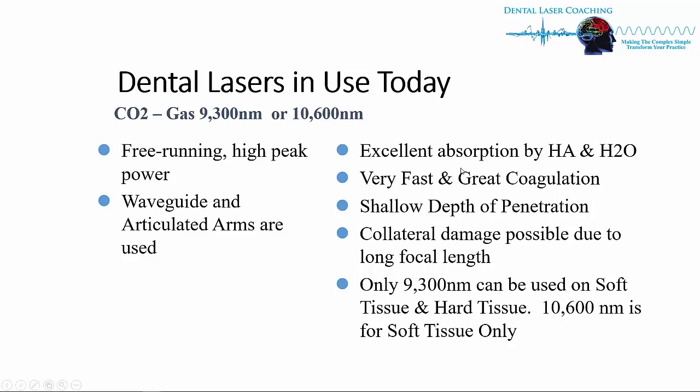Though they're thermal, they only interact on the surface when used properly. And I say that with caution because you can have collateral damage. For those of you that are used to using a diode or an erbium, you know that you have to be 0.5 millimeter to 1 millimeter off the target tissue. With these lasers, you can be inches off the target tissue, so the possibility for inadvertent collateral damage is there if you're not an experienced and well-trained user.